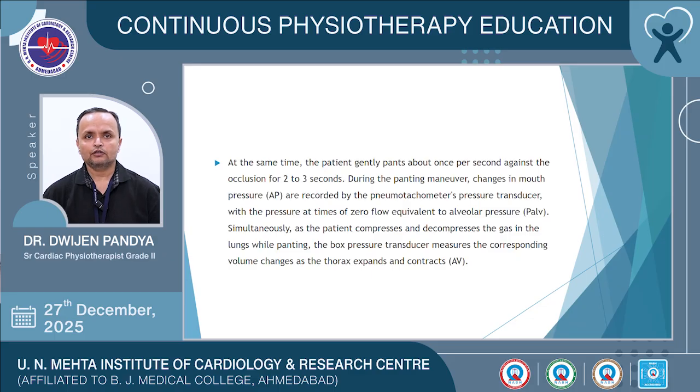Simultaneously, as the patient compresses and decompresses the gas in the lungs while panting, the box pressure transducer measures the corresponding volume changes as the thorax expands and contracts.